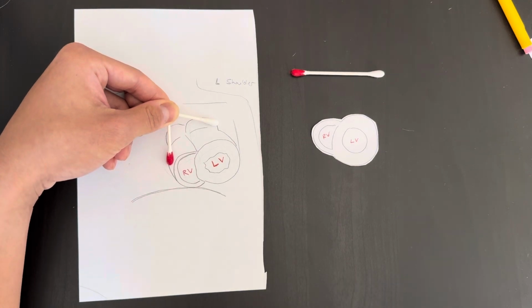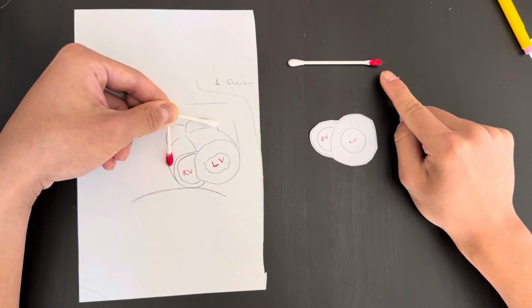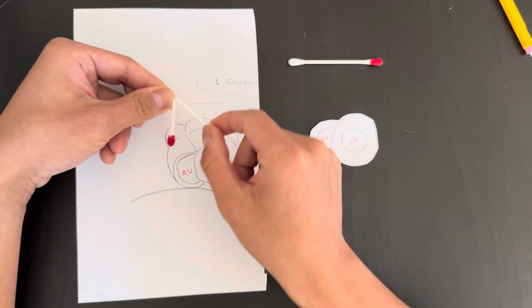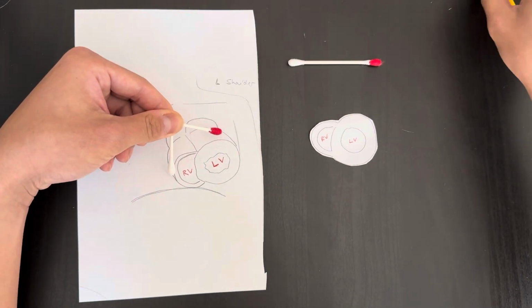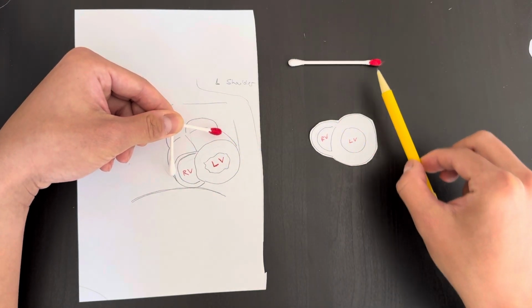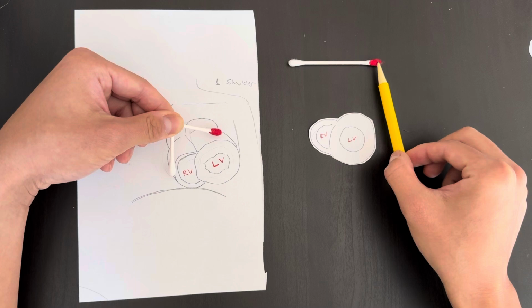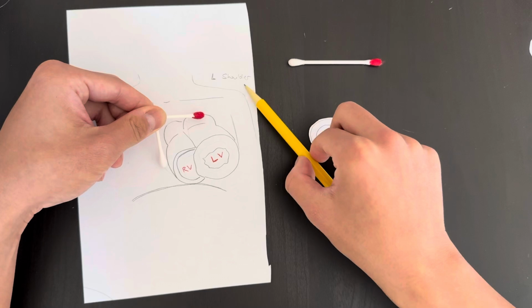Now, if your machine was on cardiology mode and the probe marker was on your right, my image still has to look like this, right? Cardiologists still want to see this orientation. So what I do is I flip my probe 180 degrees. So now I'm scanning with the probe marker to my right, pointed towards the LV, or to simplify it, people say if you're in cardiology mode and you want a parasternal short, you want to point towards the left shoulder, right? Because I'm pointing this way towards the left shoulder.